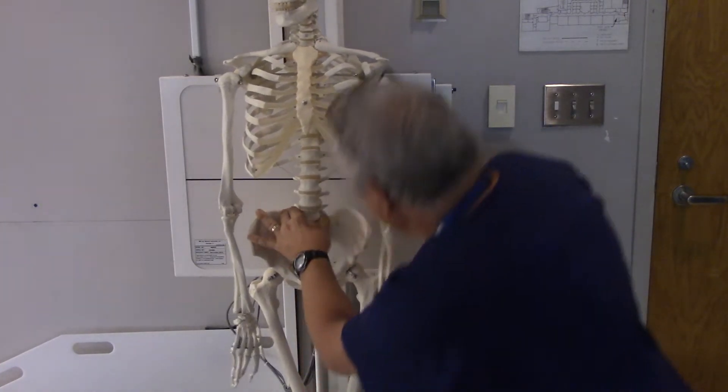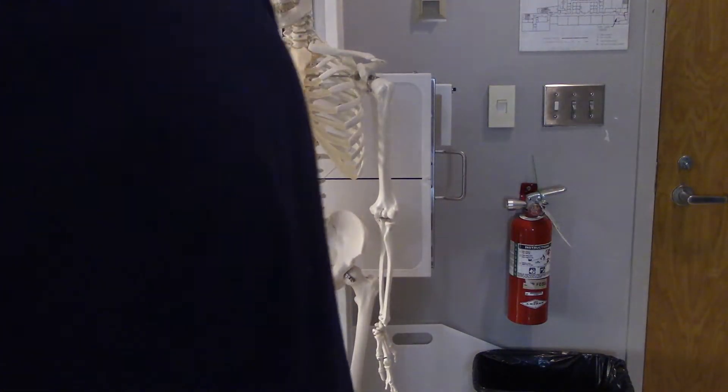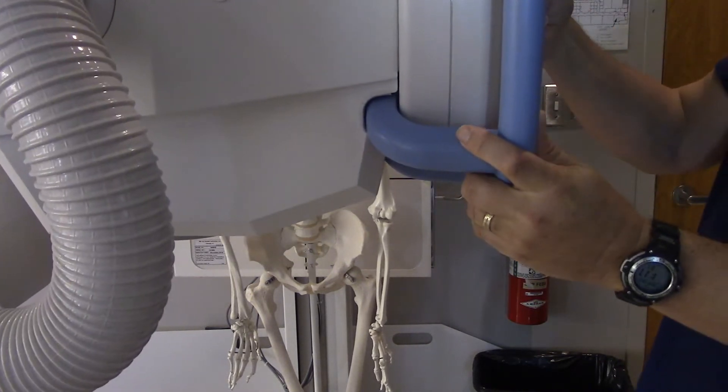One of my students is kind enough to hand me the tube, so we're just going to bring this around just like this. We may need to reposition the camera because all of a sudden we can't see too much.